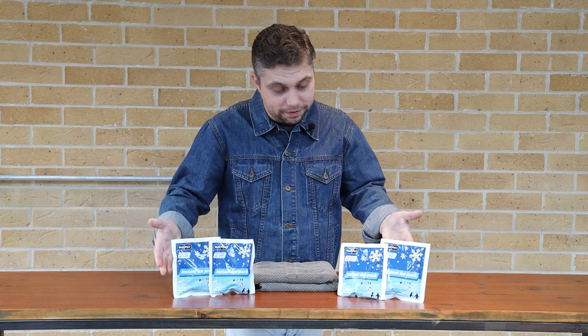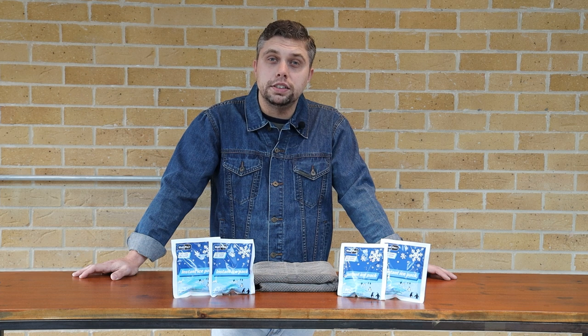Hello, it's Kern from MediSafe and today I'd like to tell you about our new Medipro Ice Packs. Our new ice packs give fast action pain relief and are ideal for soft tissue injuries such as bruises, strains and inflammation. They are compact in size and are ideal to add to your existing first aid supplies.